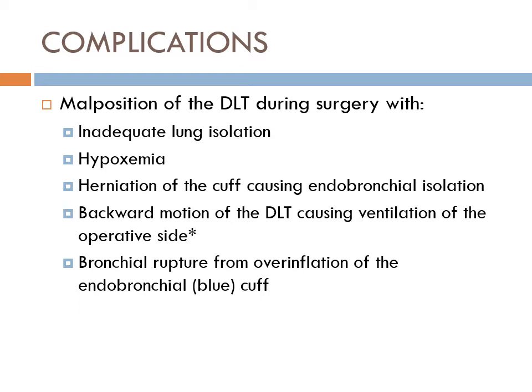And this seems like the same thing here on the backward motion versus herniation of the cuff. But this is now coming from a clinical standpoint. We're trying to problem solve. Why is this happening? We have to fix it. So what do you do? How do you recognize these things?